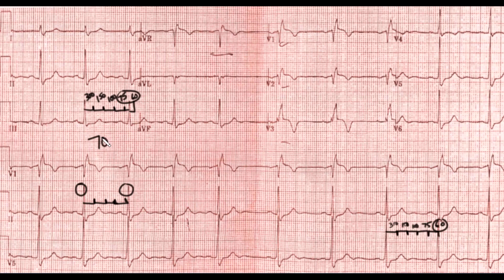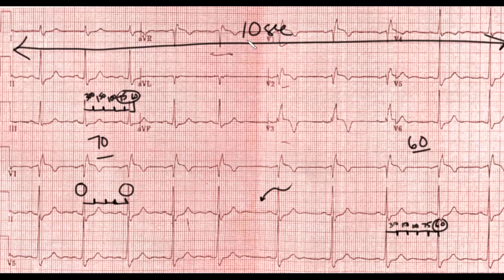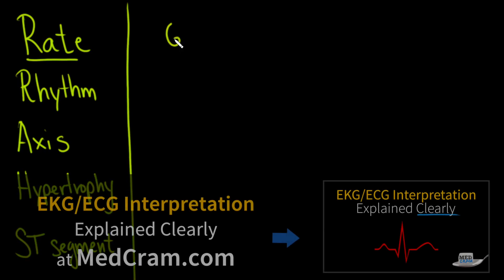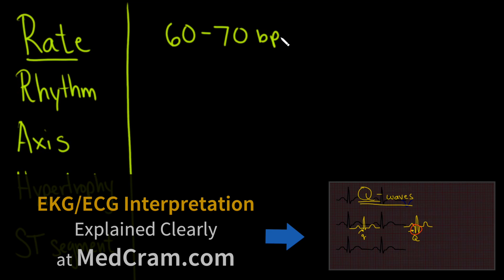Whereas over on one side it's probably around 70, over here it's probably more around 60. It looks as though something happened right about here where there was a change. Remember that the entire strip is about 10 seconds. If we count up the number of QRS complexes and multiply by six, we get the rate per minute. Counting about 10 complexes times six gives a little bit more than 60 — somewhere between 60 and 70, which is exactly what we come up with. So the rate is somewhere between 60 and 70 beats per minute.